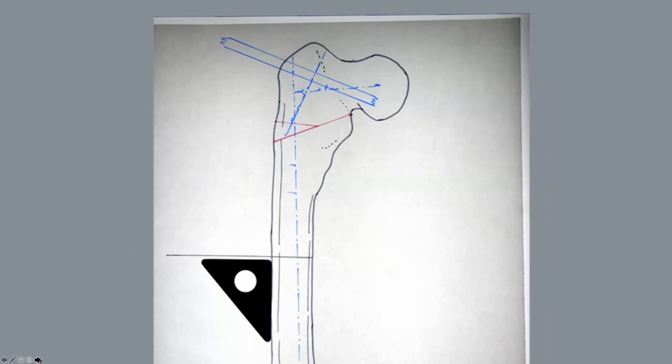You're going to look at it radiographically. You're going to make sure it lines up pretty well. And one of the things I would tell you is to pay attention to where you put this 90-degree angled guide, or any of your guides, on the lateral cortex of the femur. Because as you know, the femur has been through some trauma. Sometimes it's slightly irregular in shape. You want to make certain that you're using the right area of the cortex on the side of the femur that you planned off of beforehand, right? So wherever you planned off of, wherever you made those measurements, that's where you want to use. And you have to make certain that that pin goes in directly at 90 degrees, because everything subsequent to this, all the other pins, are going to be based on this 90-degree pin.